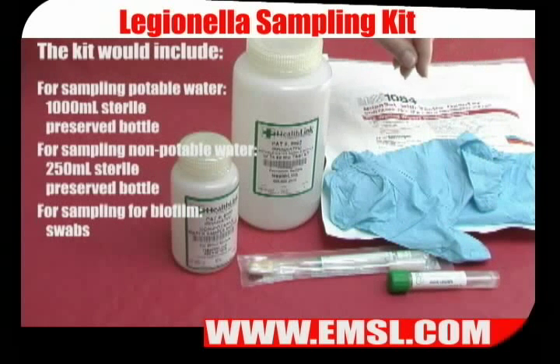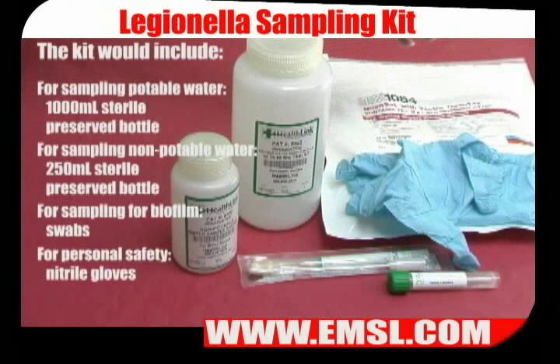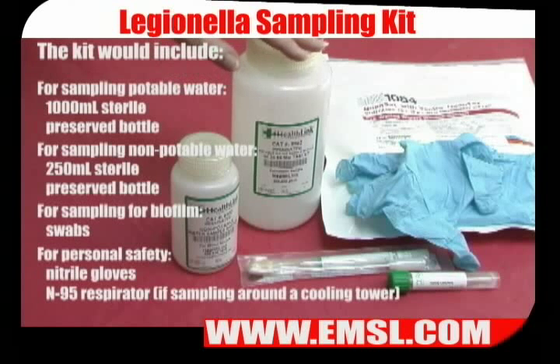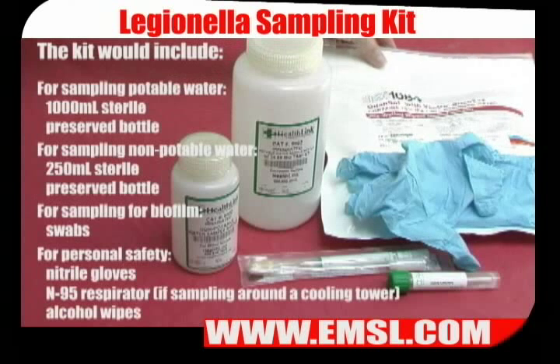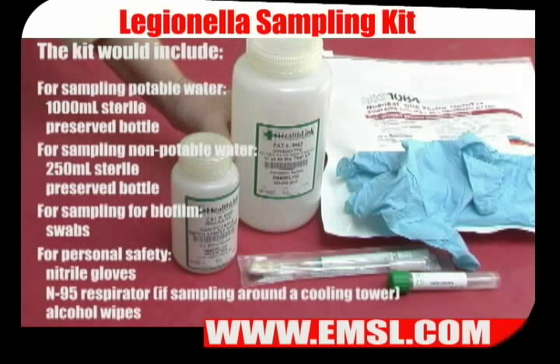In terms of personal protective equipment, you'll need nitrile gloves and an N95 respirator if you are sampling around a cooling tower, and also splash goggles. You'll also need a package of alcohol wipes to wipe down the bottles after you're finished sampling.